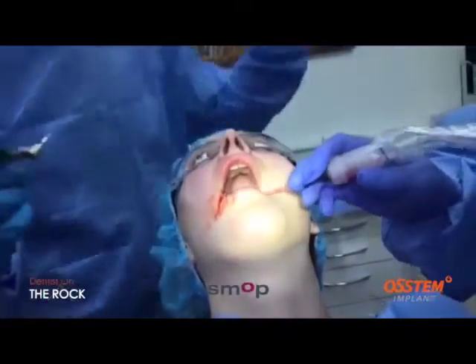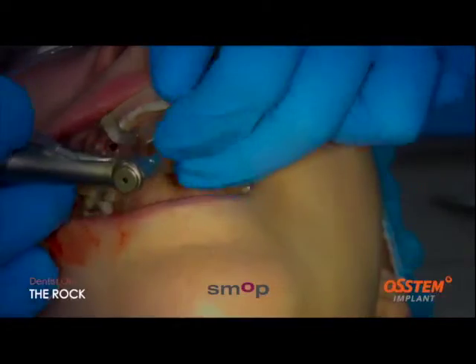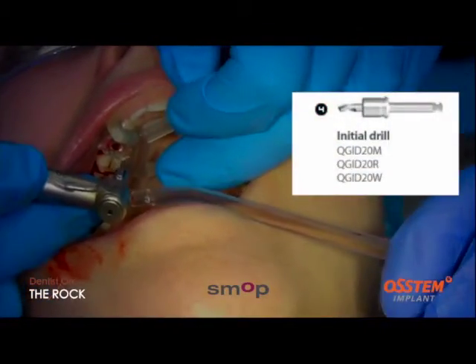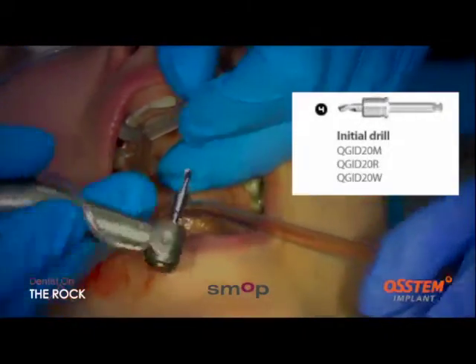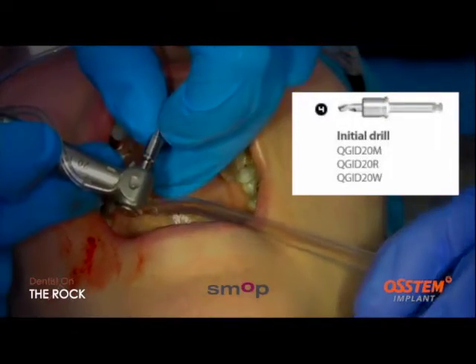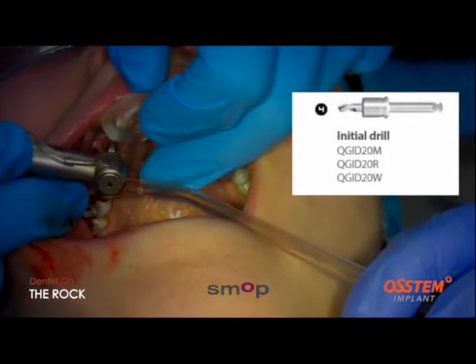Next step of where this is going to go, this is over the top. And I'm going to create the accuracy by making sure that this is fitted well by using the initial drill. The initial drill is going to fit perfectly into the guide, and it's going to create the path of all the other drills we're going to use. So that's placed in here.